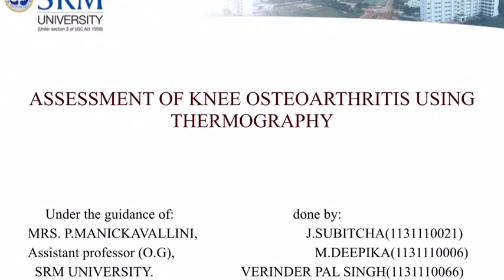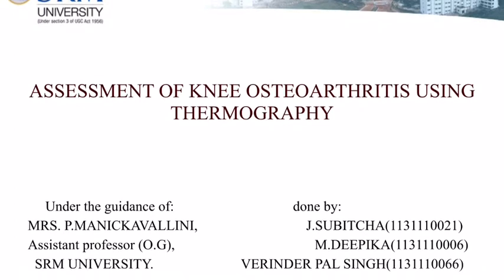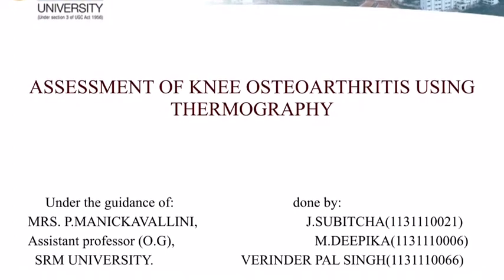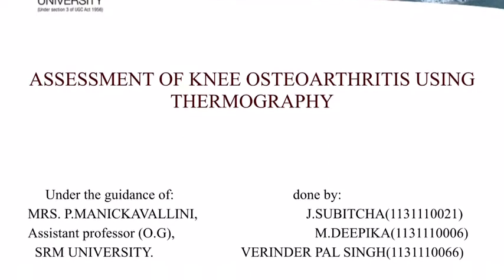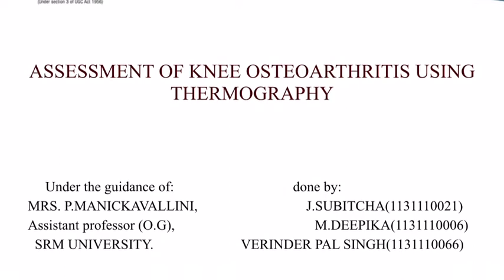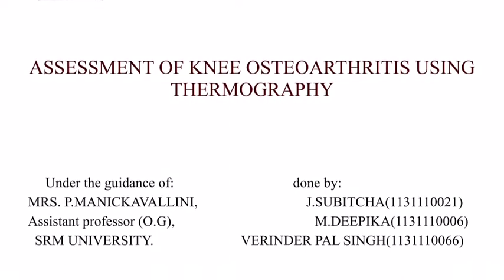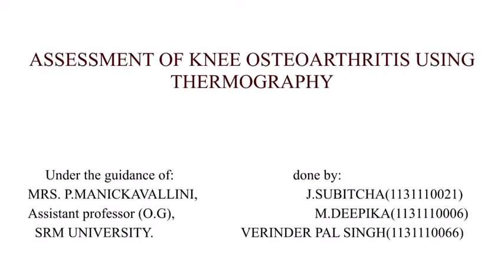Hello everyone. This is a very brief technical demonstration of our B.Tech Final Year project, assessment of knee osteoarthritis using thermography, done by Subiksha, Deepika and Virender Pal Singh under the guidance of Mrs. P. Manikavalini, Assistant Professor of SRM University. We are B.Tech Final Year Biomedical Engineering students of SRM University.